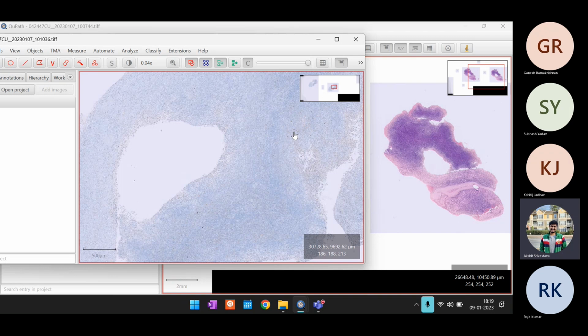So to identify the Reed-Sternberg cells, we'll just use data programming, right? So this is again the strawman approach. The strawman is: do data programming, identify Reed-Sternberg cells, and then as step 2 you do targeted subset selection to identify microenvironments, basically clustering the microenvironments around the Reed-Sternberg cells. Got it.